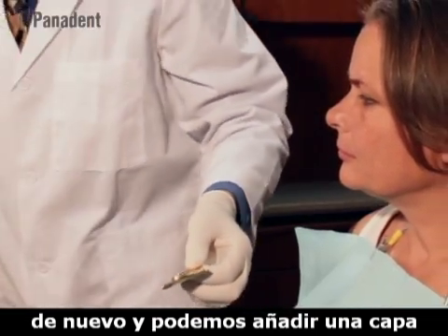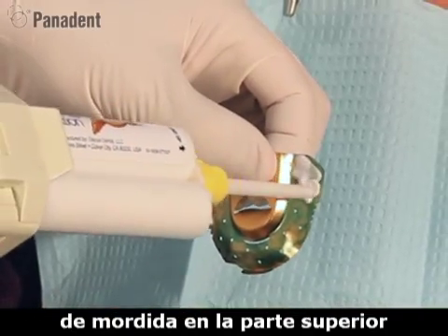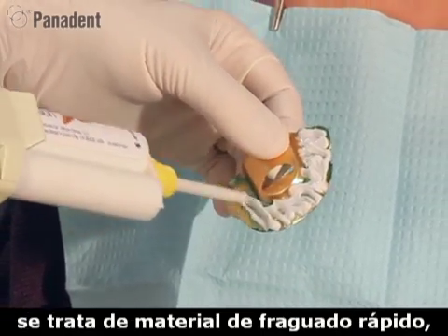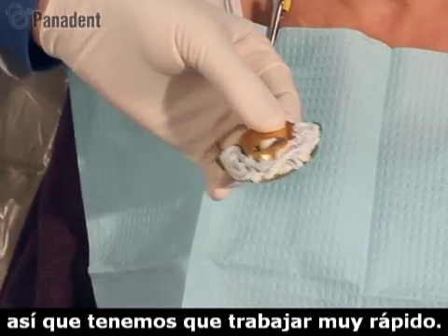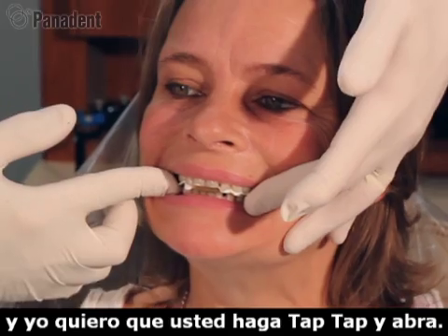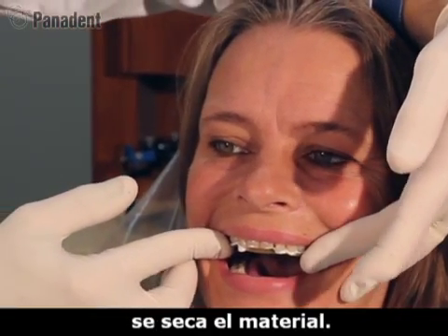And we can add a very thin layer of bite registration material to the upper side to get a registration of the upper teeth. So I'm going to just do a very thin layer of this. This is fast setting material, so we got to work real fast. So open, please. I want you to just tap, tap, and open. And I'm going to hold this against the upper teeth while the material sets.